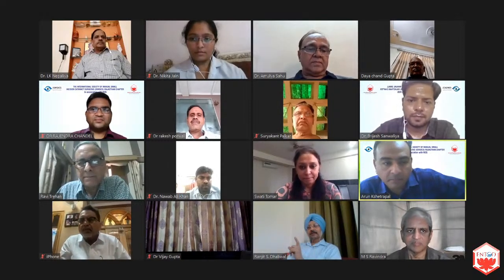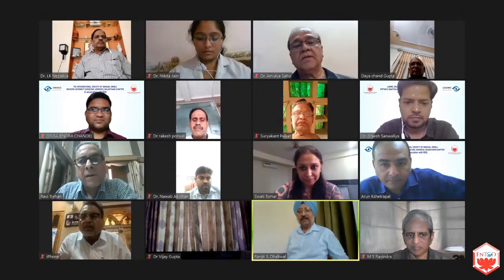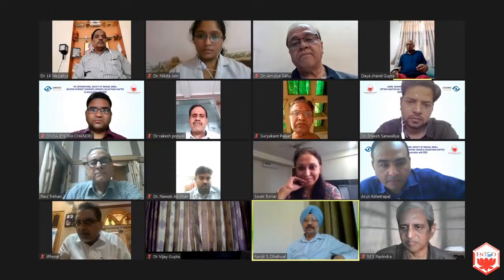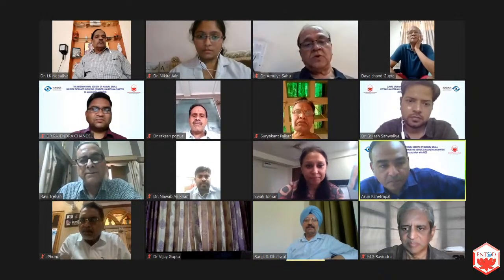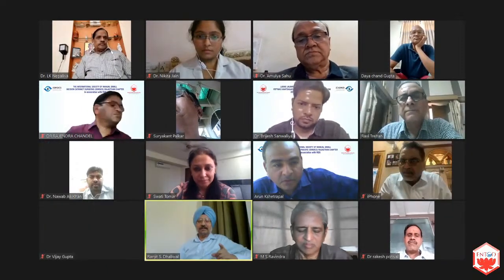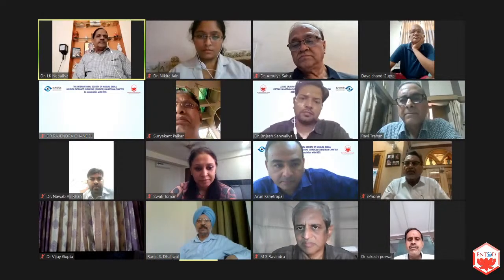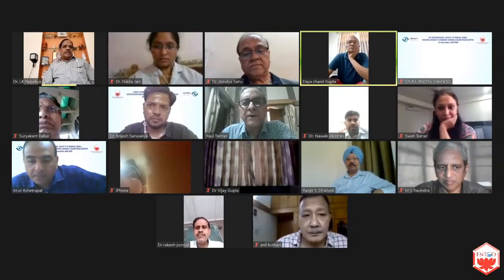Dr. Jayashree, are you there? Yes, Dr. Dhaliwal, you want to say something? I for one would suggest a slightly oval capsulorhexis and a little eccentric towards the tunnel. It makes all the rest of the steps very easy and we are very comfortable later on: bringing out the nucleus, placement of the implant, and then that 12 o'clock cortex, aspiration of the cortex. Subcapsular, yes. Really nice. That becomes easy.